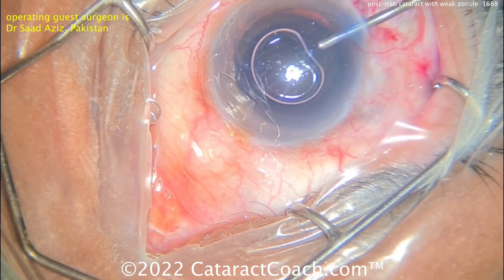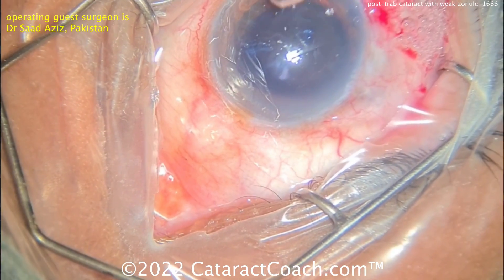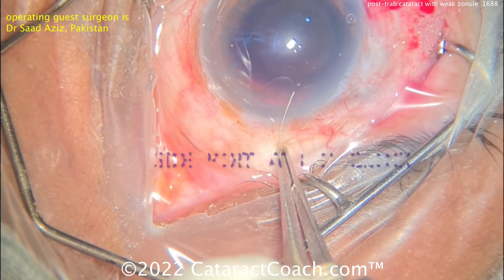Here comes trypan blue dye, some viscoelastic going inside the eye, and let's take a look at that capsulorhexis.